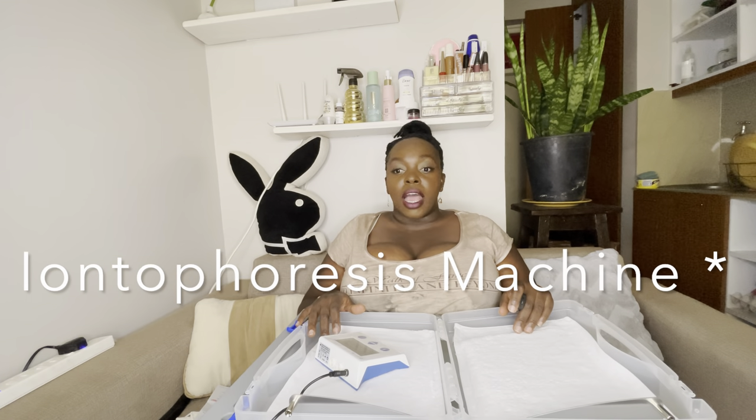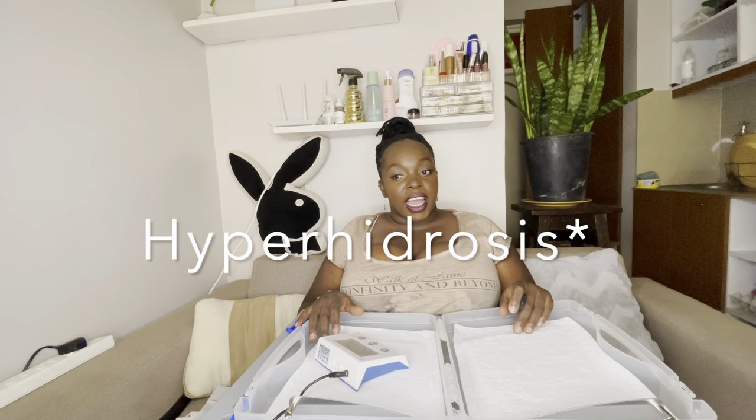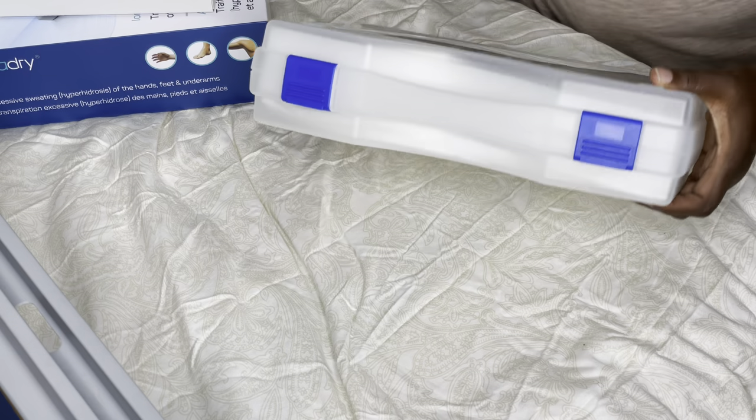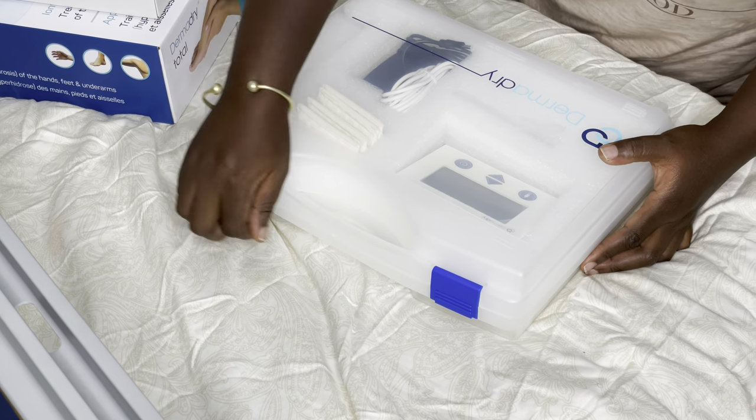Hi guys, today's video is about the DermaDry Total machine. It treats excessive sweating — hyperhidrosis — of the hands, feet, and underarms. It comes with a controller, and the DermaDry Total box comes with a case — a plastic case — that you can actually do treatments with.